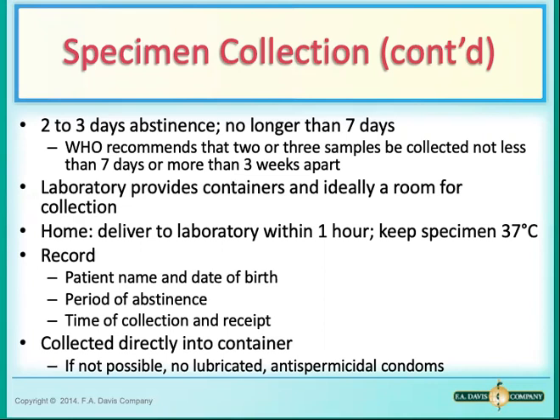And usually specimens are collected by masturbation into the container. If that is not possible, only non-spermicidal, non-lubricant-containing rubber or polyethylene condoms should be used. Ordinary condoms are not acceptable because they contain spermicides.